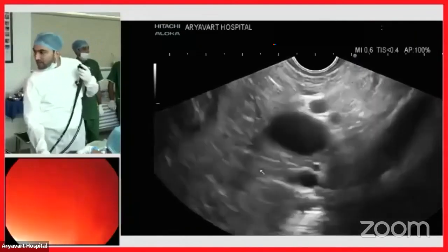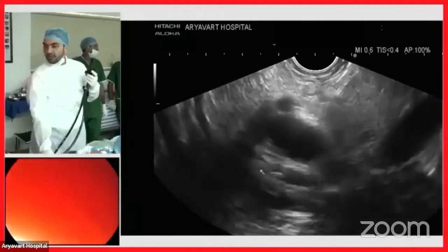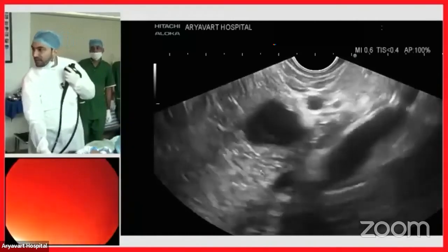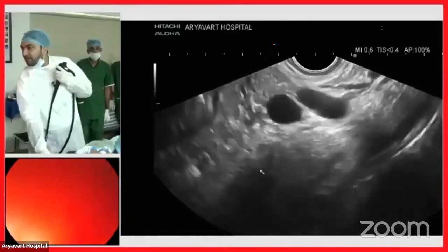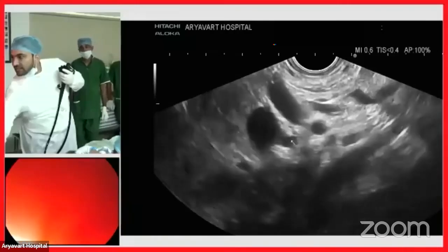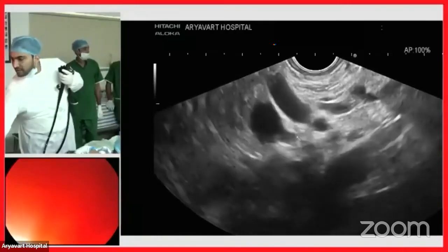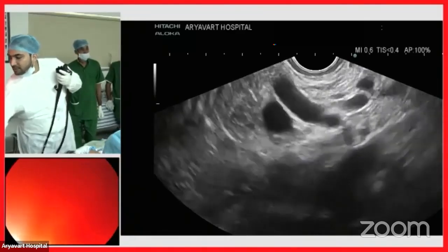I would have liked to see the left gastric somewhere because she has esophageal varices, which are usually supplied by the left gastric vein. I don't see a left gastric takeoff, at least in this axis. Possibly this one. Yes, yeah. Right here. We see this takeoff coming from the... Can you measure the diameter? Left gastric. So the left gastric takeoff is approximately 3 millimeters.